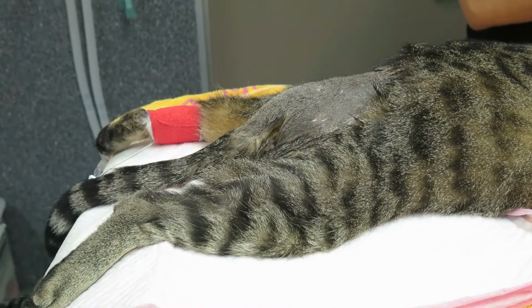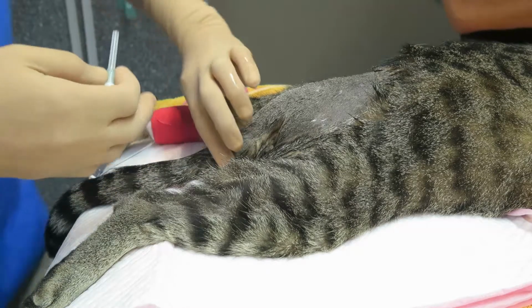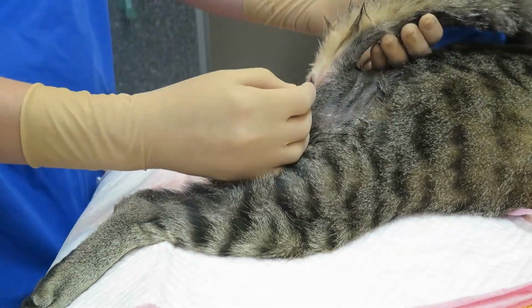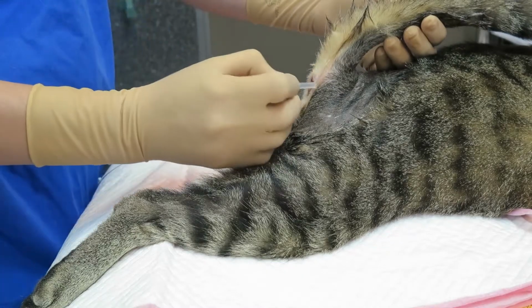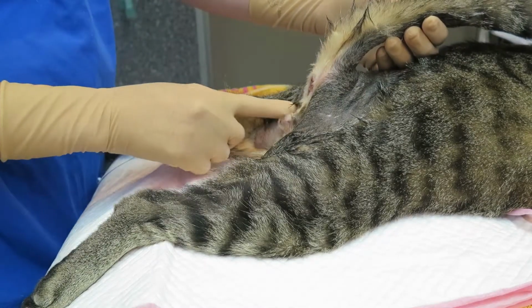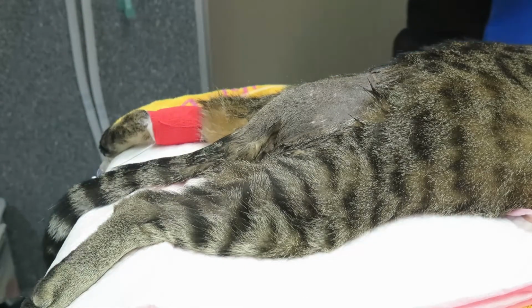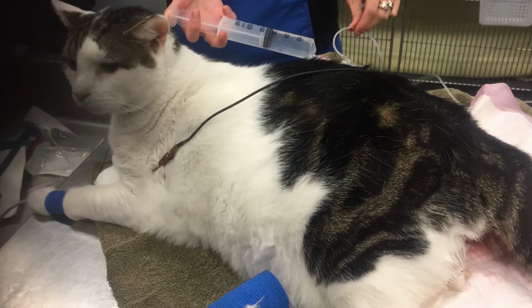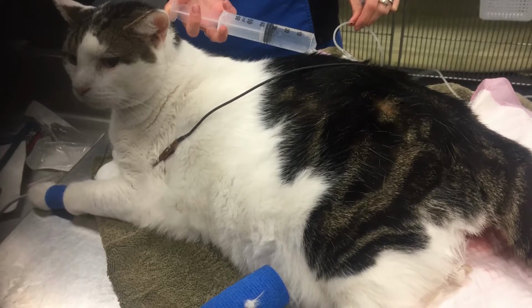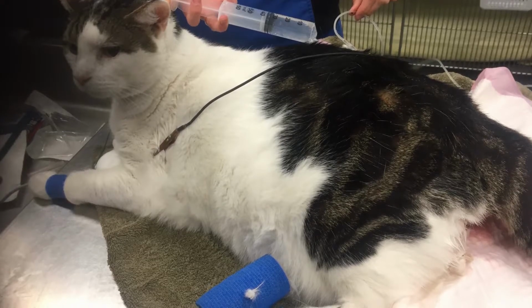And generally we find that this is a very, very well tolerated procedure. If it has worked appropriately, and it works in about 70 to 80% of cats, then about 10 minutes later we should find that there are reduced tail and perineal responses, and the bupivacaine alone can provide good analgesia for about a 10-hour period in most cats.